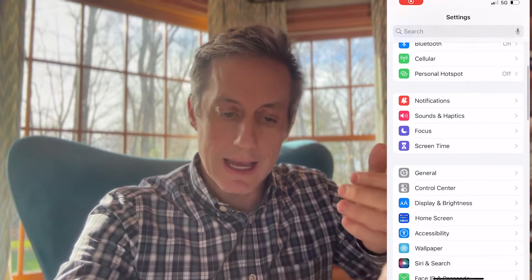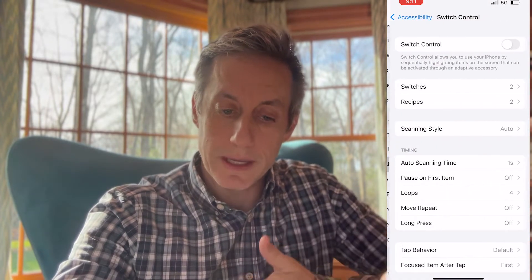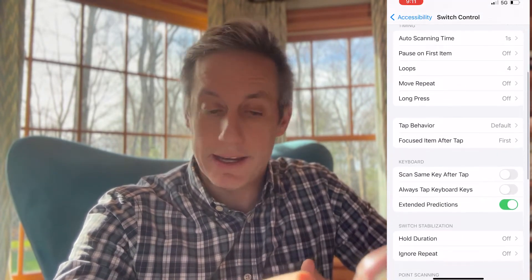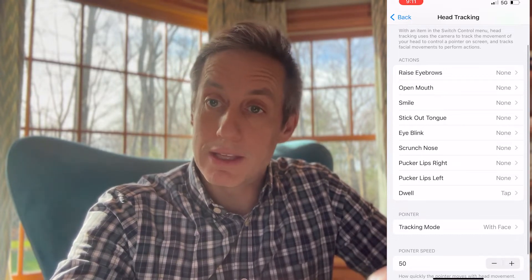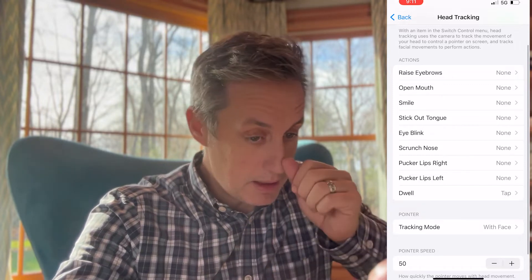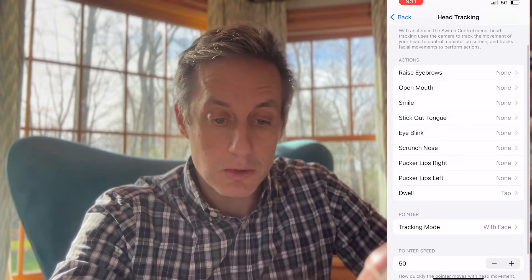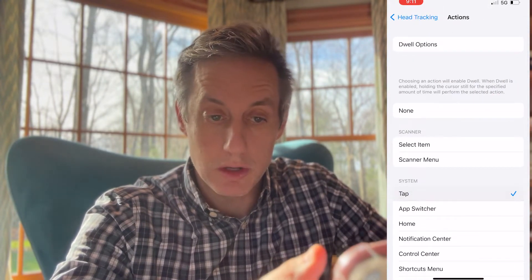The key thing is in the accessibility features. If you go into Settings and then Accessibility, there's a Switch Control. That Switch Control has head tracking. So if you turn head tracking on and go to the Dwell setting — now, depending on your kid's abilities, there might be some other ways that they can access these things and make it more specific for them.